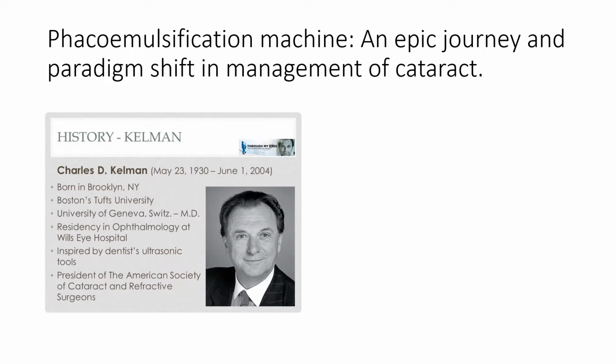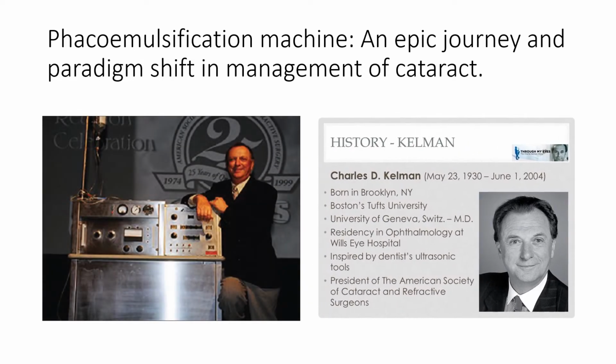This was an epic journey, and there's a paradigm shift in the management of cataract, and it was initiated by Dr. Charles D. Kelman, an American, who was a resident in ophthalmology at Wills Eye Hospital, and he was very much impressed with the scaling machine which his dentist friend was using to scale the plaques on the dental surface, and he took that idea and conceived this machine which is seen here in a picture, and this is the earliest possible phaco machine which he designed and used to extract cataract.